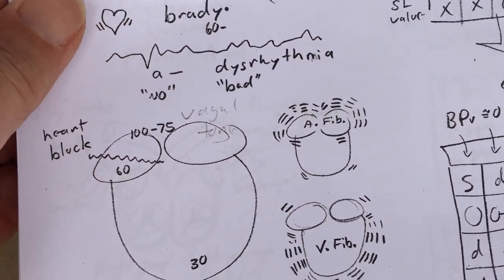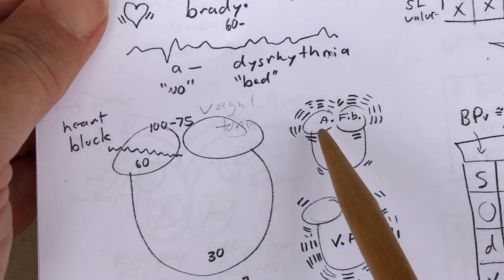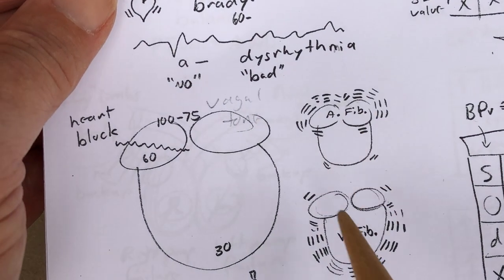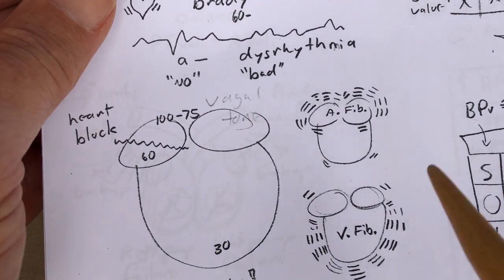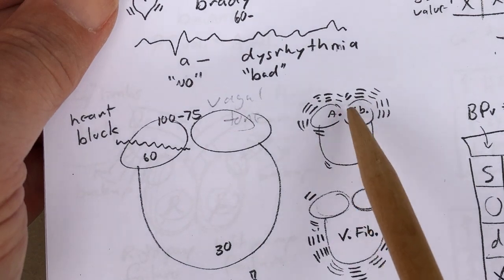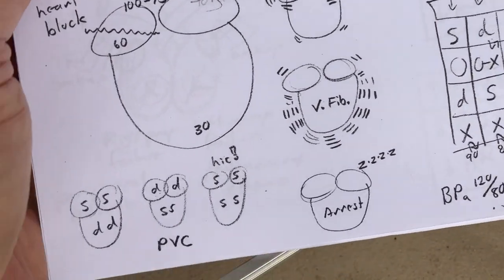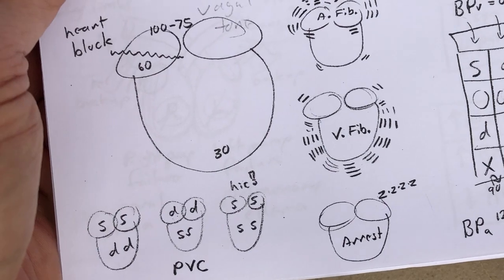One example of a dysrhythmia that's very dramatic is fibrillation. Well, this would represent a cartoon version of atrial fibrillation, and this one ventricular fibrillation. In this situation right here, there is no coordination of the muscle contraction. It's like ectopic foci everywhere, and the bag is just jiggling back and forth and jiggling back and forth, and so the pumping is just not there. Speaking of not there, cardiac arrest. In cardiac arrest, there is no contraction, so again, flat line.